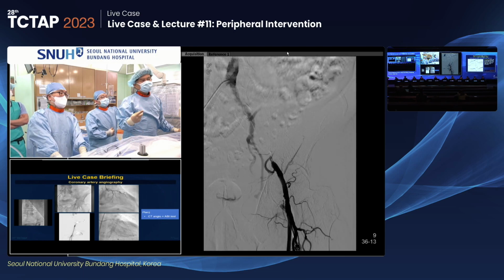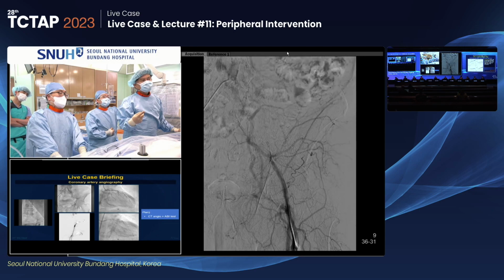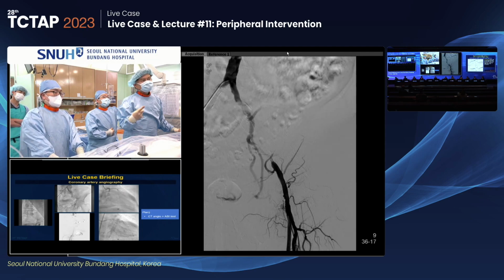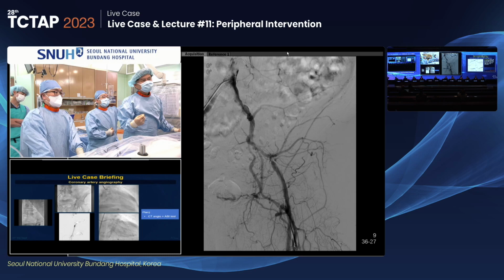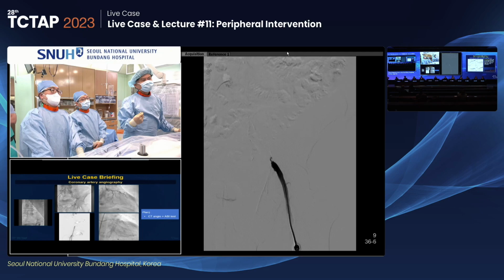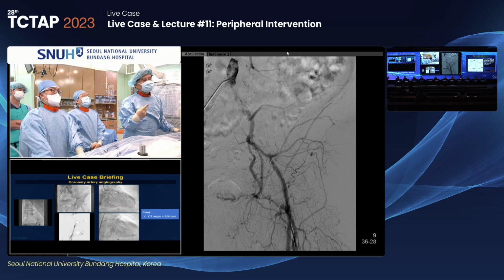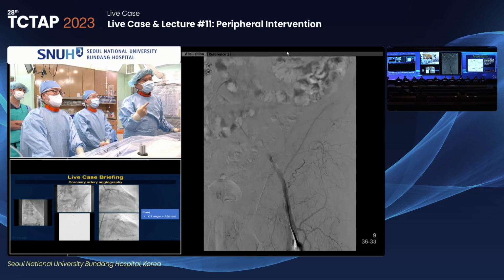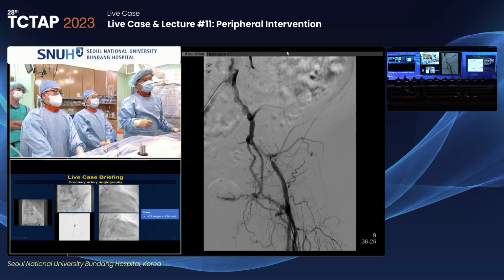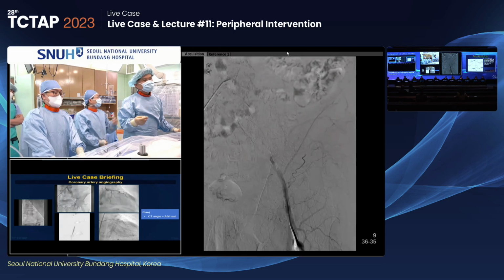Usually at this angle we can expose the possible stump, but for a left iliac bifurcation, you want to do an RAO projection. Dr. Laird, can you see the stump? No, it looks like this view is just an AP view, though, isn't it? That's 0, 0 up in the left. This is a severe one. I think it is very much angulated in the RAO view. Okay. So to identify the stump, can you do a very severe RAO? Yeah, RAO, and next view.